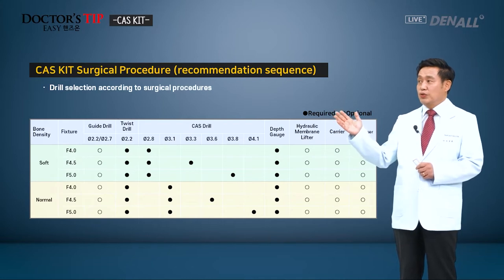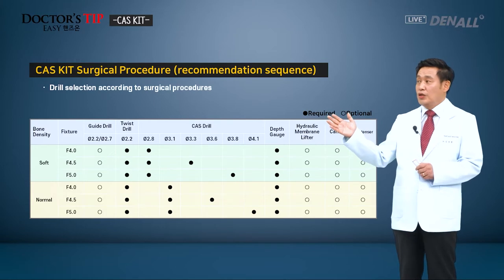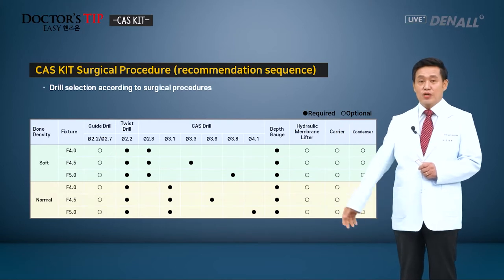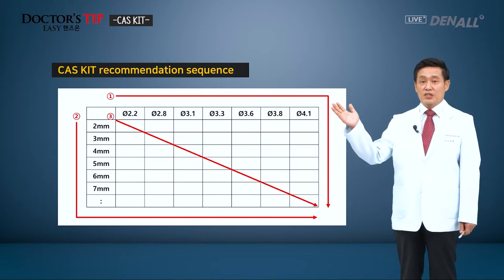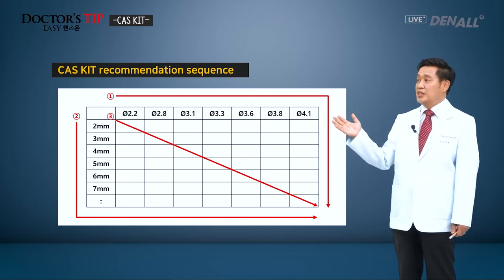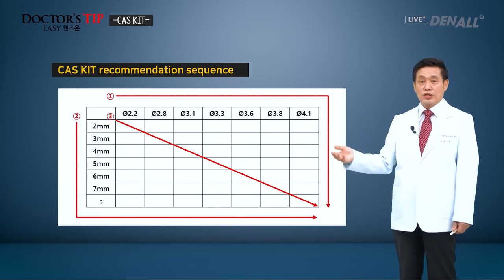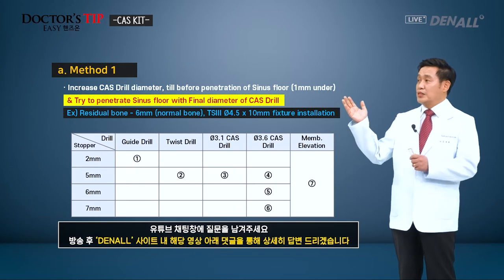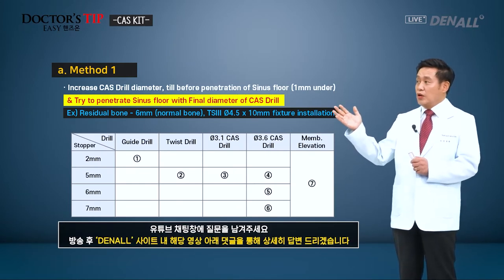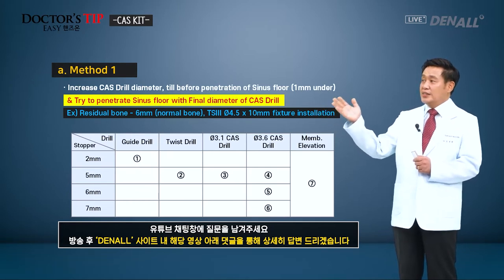There's a recommended sequence for the CAS KIT surgical procedure. I will try to explain it in an easy way so that you can understand better. There are basically three sequences of drilling in our recommendation, and I will use some diagrams to explain it. The first method: before we penetrate into the sinus floor, CAS drill diameters are increased step by step.